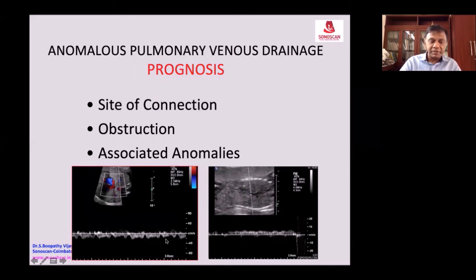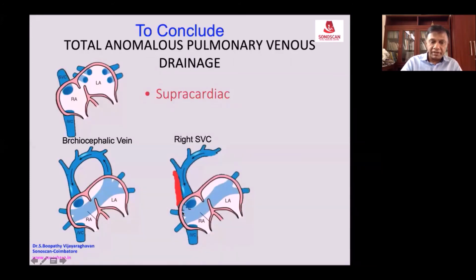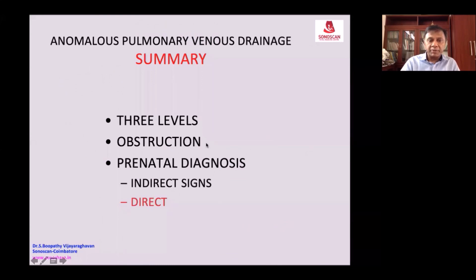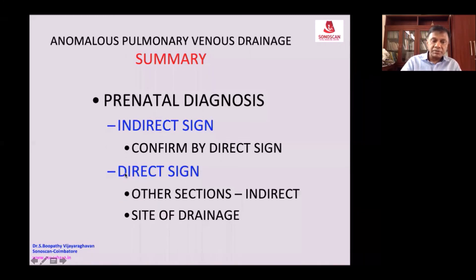This is the normal appearance of the pulmonary vein. When it is not obstructed, the vertical vein is on the right side instead of the left. All the veins form a confluent vein which goes to the right and ascends as a vertical vein by the side of the right SVC and joins it. On cross section, you will see the coronary sinus crossing the left atrium to join the right atrium. If any of these are obstructed, this is evidenced by continuous flow on spectral Doppler. The emphasis should be on direct signs — once you see that the pulmonary veins are not joining the left atrium and they form a confluent vein, there are two different approaches for arriving at the final diagnosis of TAPVC.